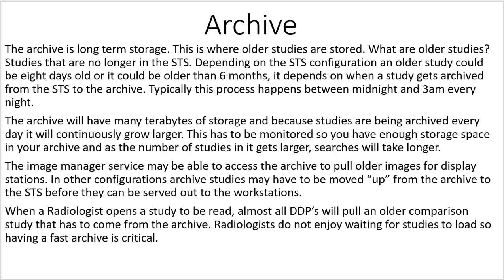every night. The archive will have many terabytes of storage, and because studies are being archived every day, it will continuously grow larger. This has to be monitored so that you have enough storage space in your archive, and as the number of studies in it gets larger, searches will take longer.